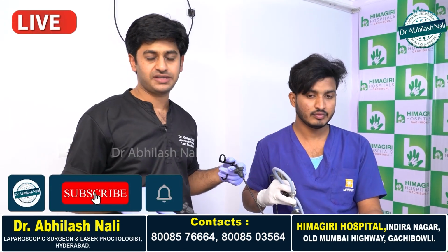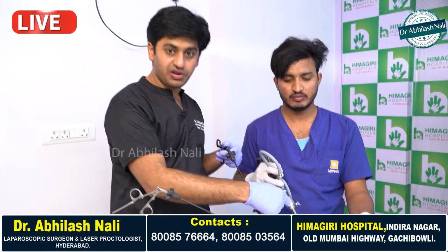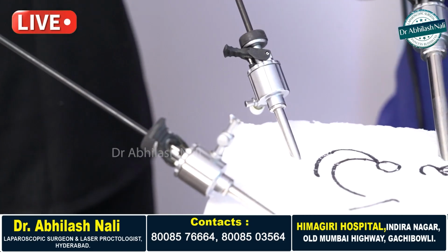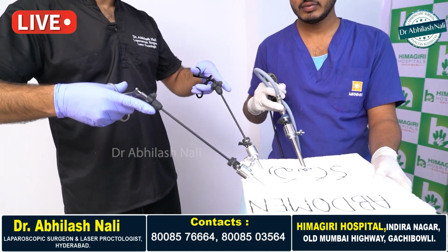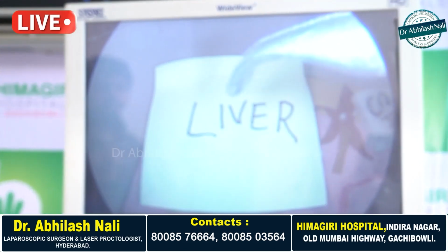In laparoscopic surgery, generally we require a minimum of 3 ports. One port will be for the camera, through which we connect to the monitor, and the remaining 2 will be the working ports. These are the right and left hands of the surgeon, and these instruments will be guided by the camera.